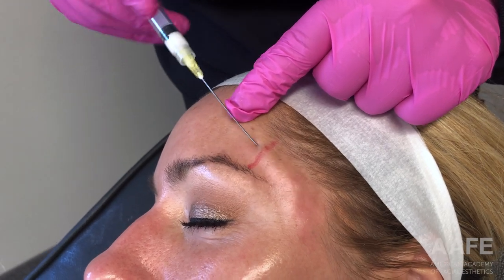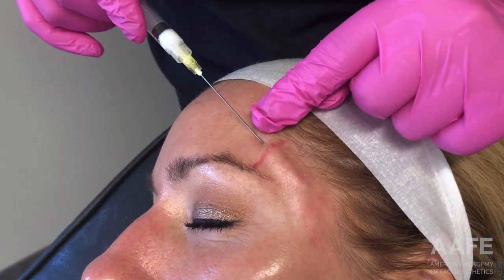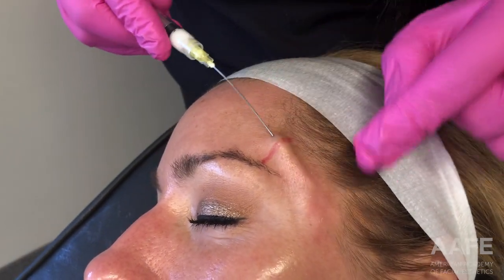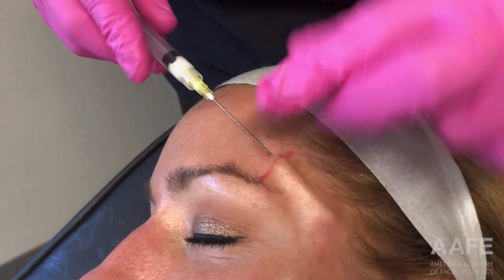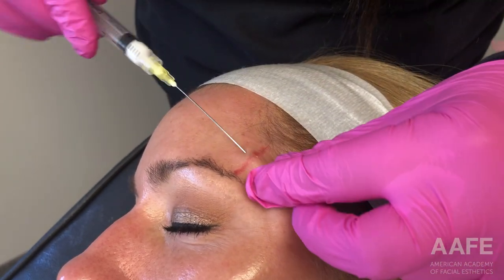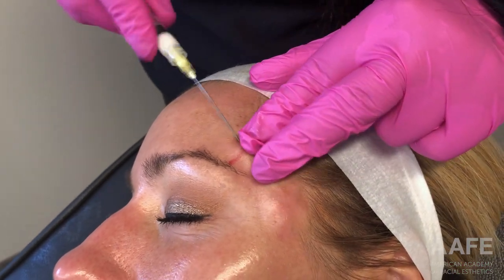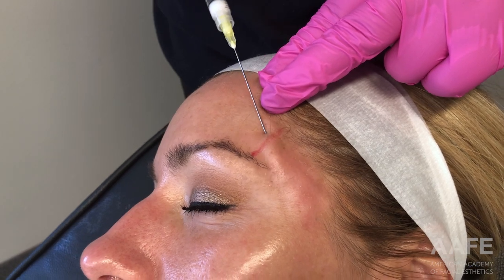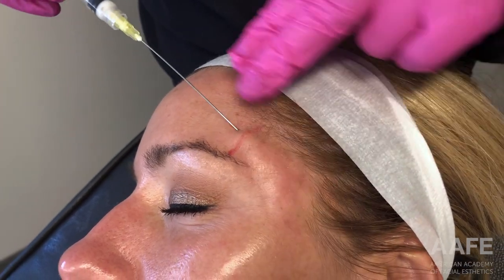Radiesse is a product that definitely has some swelling properties. Once you start to manipulate the product, you will see some swelling as well. So at the end of the procedure, this patient's temples do look a little swollen, and that is expected. We are putting about one and a half cc's of material into a fairly small space with thin skin, but luckily it reabsorbs quite quickly — by the following morning she was looking completely back to normal. The massage is just an important step to make sure everything feels smooth before you send them out the door.